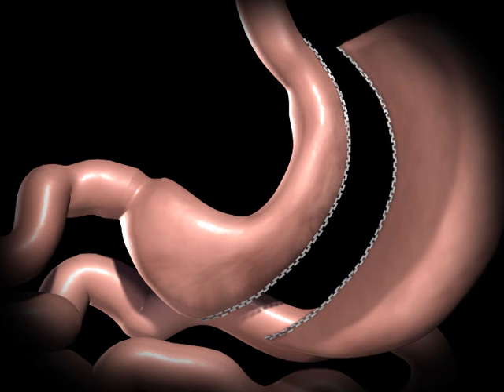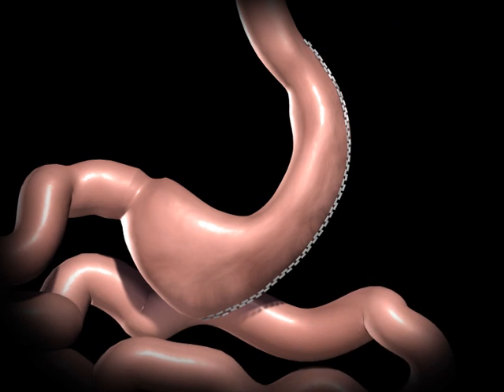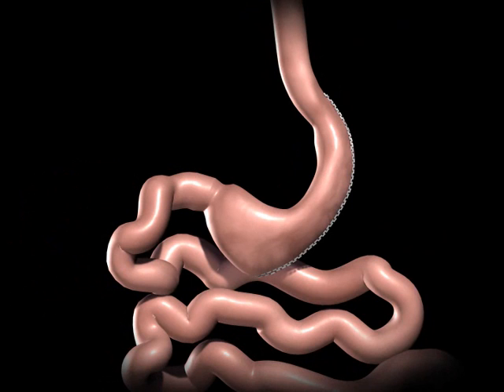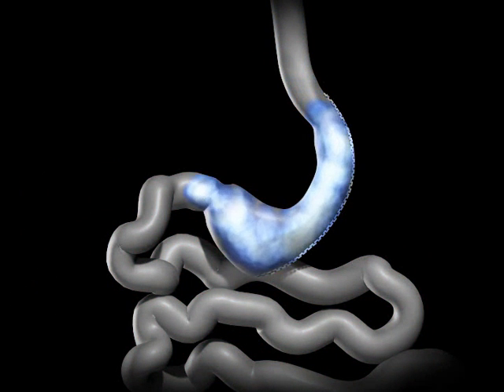The excised portion of the stomach is removed. The newly created gastric sleeve is able to hold approximately one-tenth of what the stomach was able to hold before. This smaller stomach sleeve restricts the amount of food you can eat before feeling full.